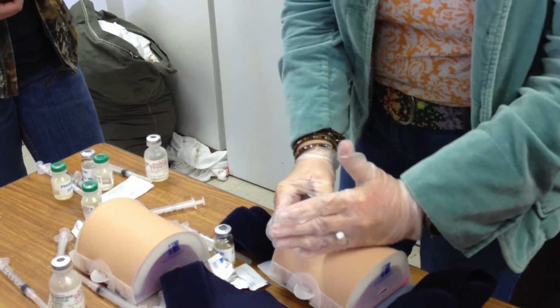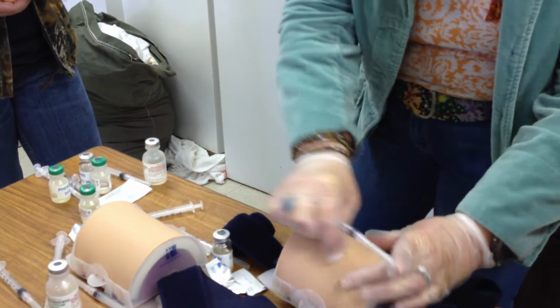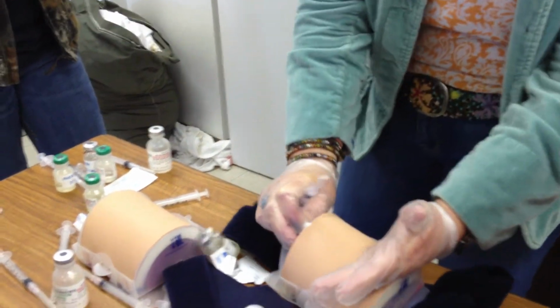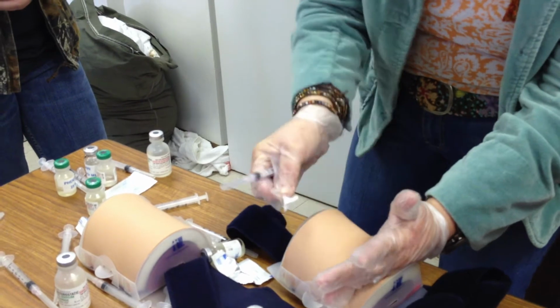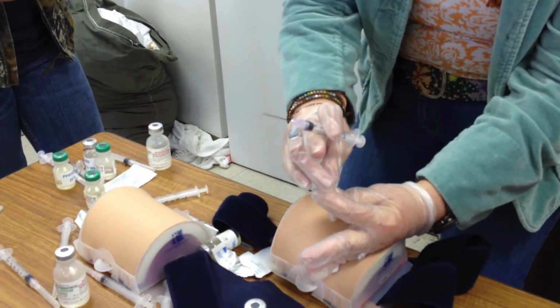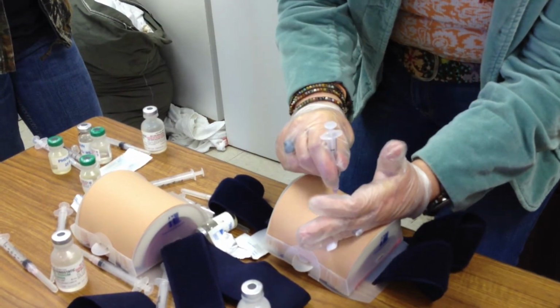But the important points are displace first, because otherwise you're going to rake right over your clean site. If you clean and then displace, your hand goes right over the place you just cleaned. So clean, okay? Put your thing over here. Make sure you have your pincher fingers ready to help. Get that out of my way. Now I'm going in.